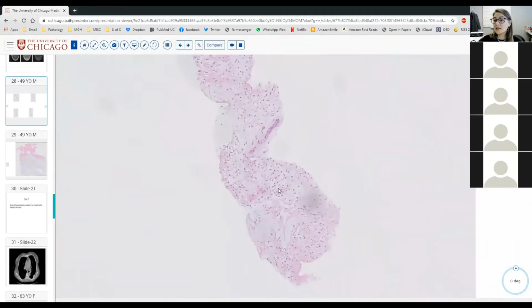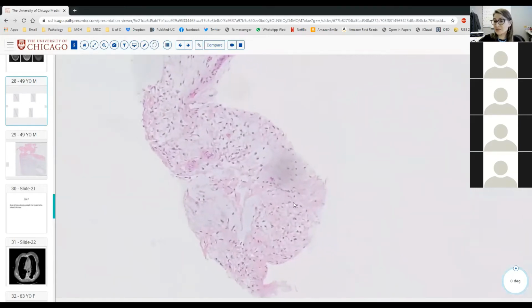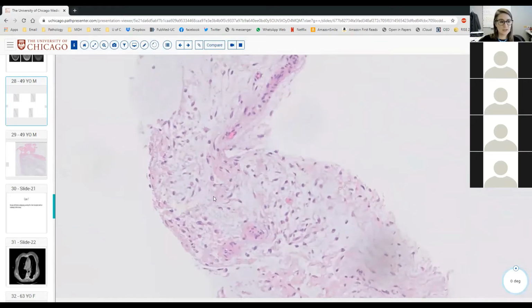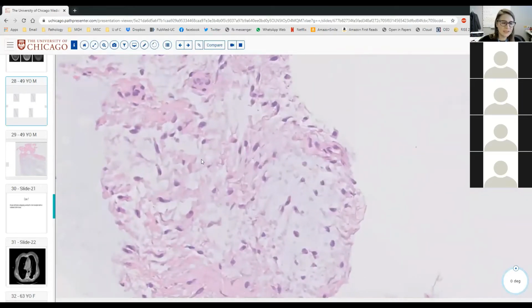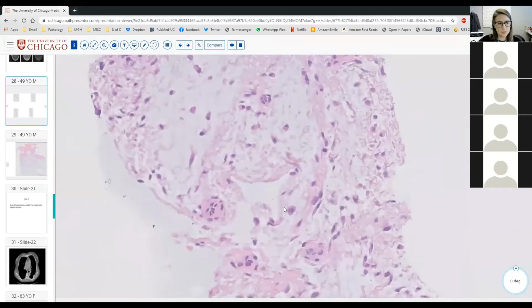Got it. So myxoid nerve sheath tumors should certainly be very high on your differential for bland-looking spindle cell lesions, because it's an easy thing to consider and rule in or rule out with your immunostains, right? Even though the nuclei here aren't perfectly wavy or buckled, arguably a little more oblong and ovoid, a nerve sheath tumor will be something to consider.